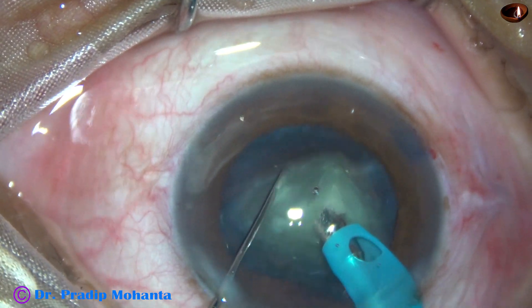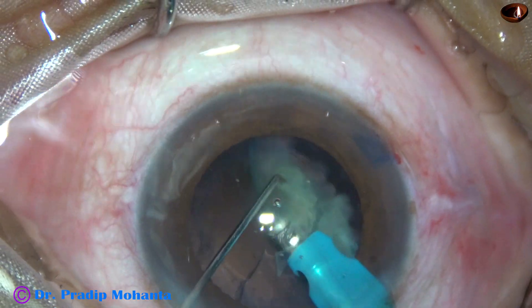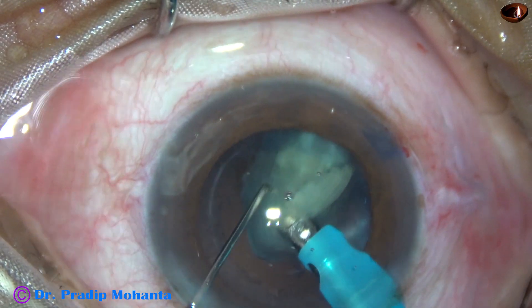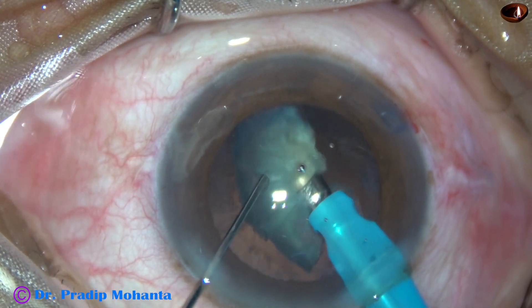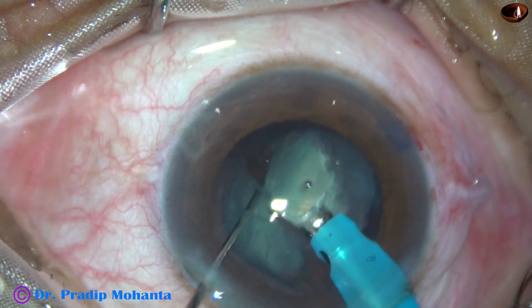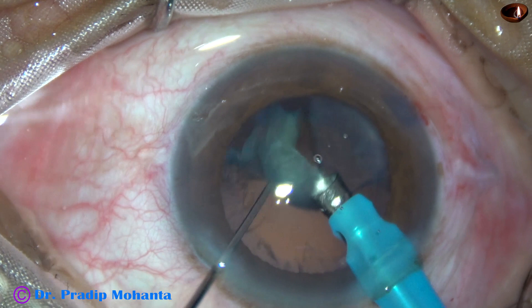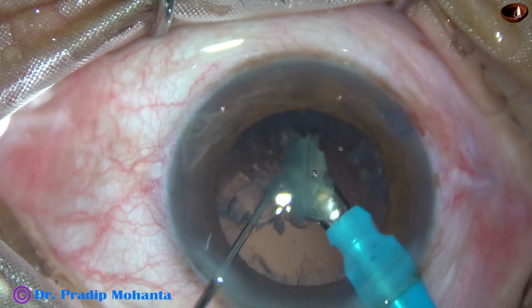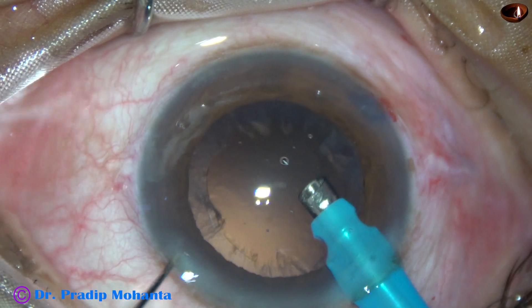This is the last nuclear piece. At this time we have to be extra cautious. We must observe the anterior chamber stability. We may even go to phaco on mode and slowly emulsify this piece with very low vacuum. In this case I kept the chopper to support the posterior capsule.